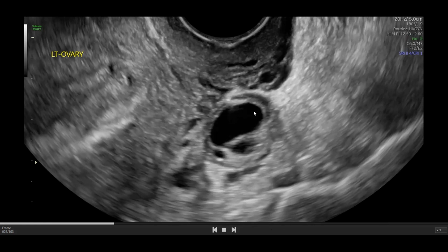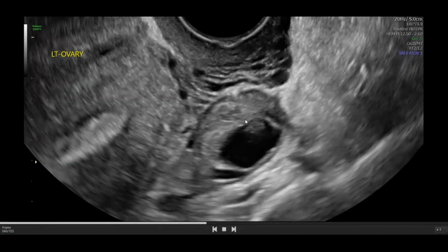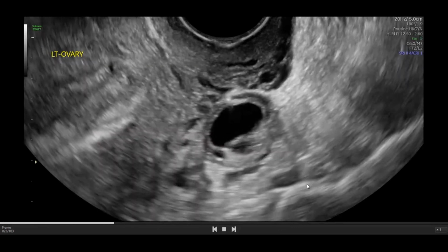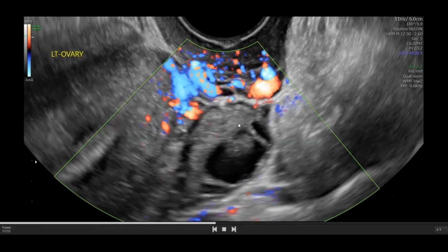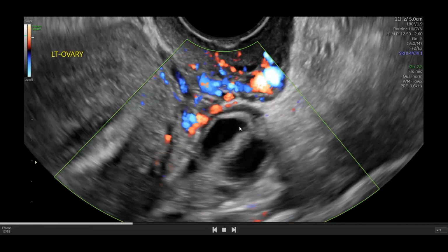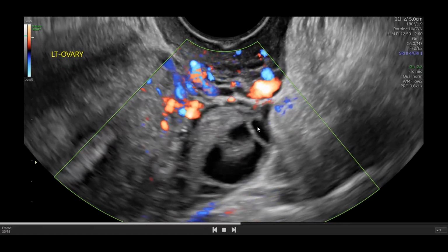So that's the left ovary, scanning through it just again there. In any of these little cystic areas, which are going to be described as follicles, there are no solid components. There should be a Doppler cine or at least a still. Here we go. Making sure that this is not dramatically vascular. Of course, we expect some vascularity. It's an ovary. So this is totally normal. Not too fussed about it.